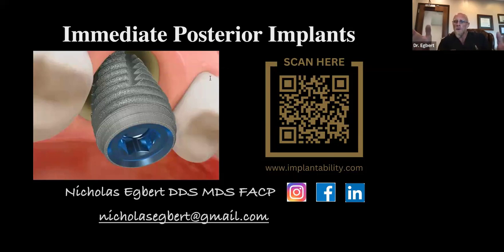Sometimes we'll expand the emergence profile, sometimes we won't. It just depends on the tissue position, thickness, and what we're trying to accomplish. So my advice is any good lab that's willing to communicate with you and follow your prescription. I say that all the time too. You're writing a prescription, not a suggestion. And a lot of labs these days just fill these prescriptions however they see fit. But the idea is to fill it as if it were a medication, exactly as written.